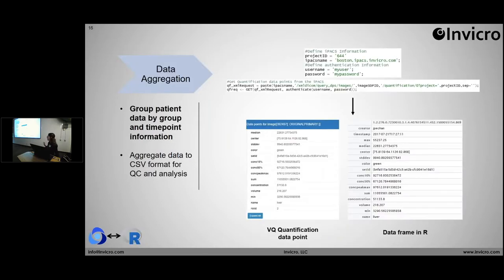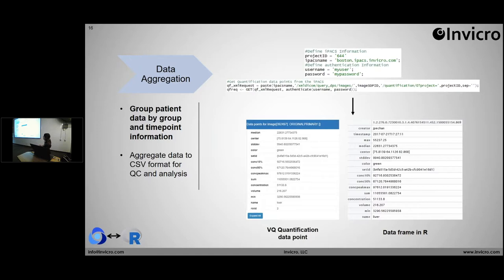Moving on to the next software: now you have your processed data, your segmentations, and it's all on the IPACS. What do you do with it? Normally people think to export it to a CSV through IPACS reporting, but another option I find really useful is directly importing it into R or MATLAB. You can define some parameters about the IPACS and the project, as well as your authentication information, and submit the request to the IPACS to retrieve the data directly into R. The result on the left shows the VQ quantification data point on the IPACS, and the image on the right is what I see in R.